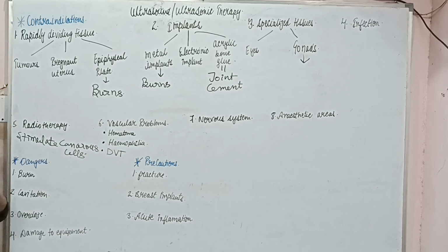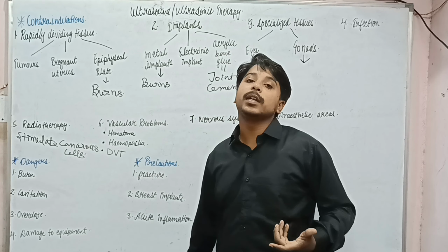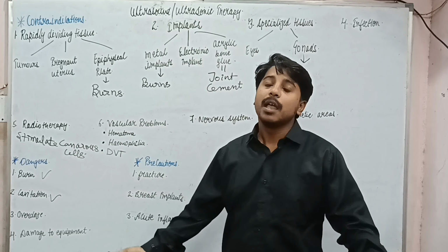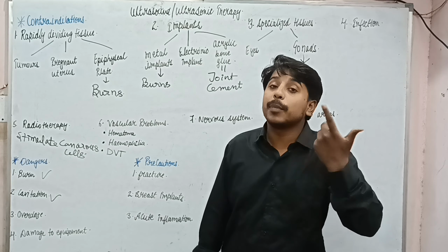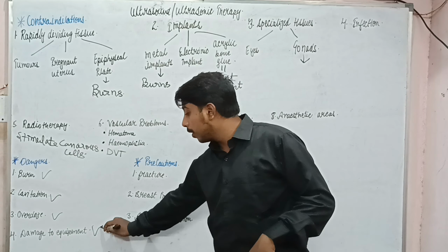Next is the dangers. Okay, what are the dangers of ultrasound application? If we are applying and we are not moving the transducer head as required, it may cause burn, it may cause unstable cavitation, which can produce temperature and pressure changes, which can produce a lot of pain and discomfort. Then is overdose, and next is damage to equipment.